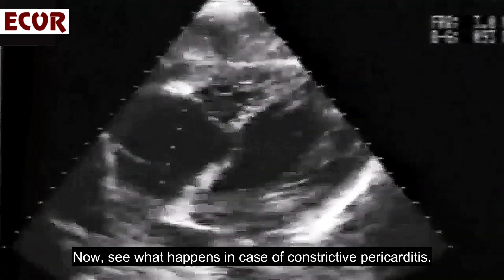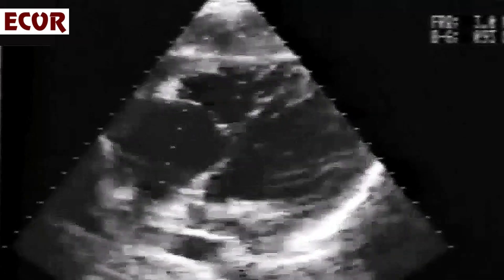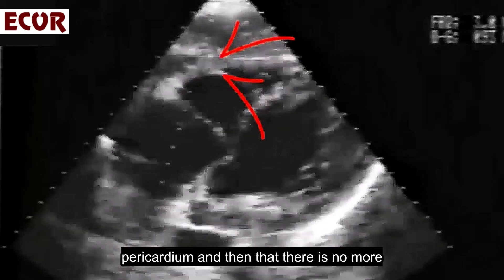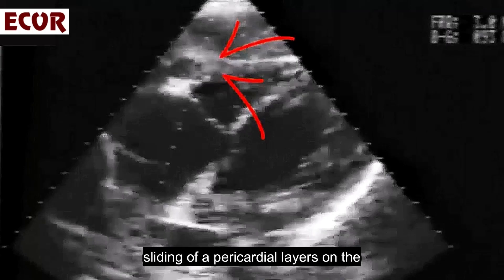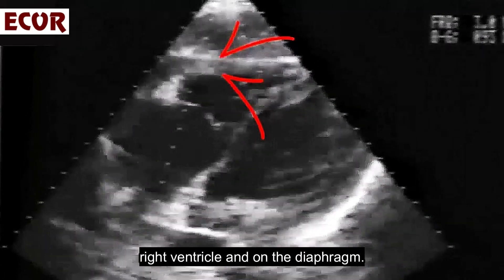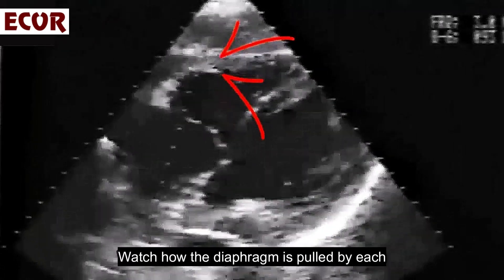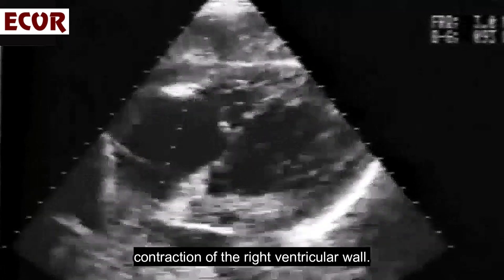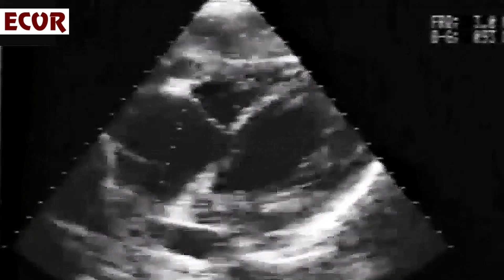Now see what happens in a case of constrictive pericarditis. Notice right away how thickened the pericardium is, and then that there is no more sliding of pericardial layers on the right ventricle and on the diaphragm. Watch how the diaphragm is pulled by each contraction of the right ventricular wall. This is characteristic of constrictive pericarditis.